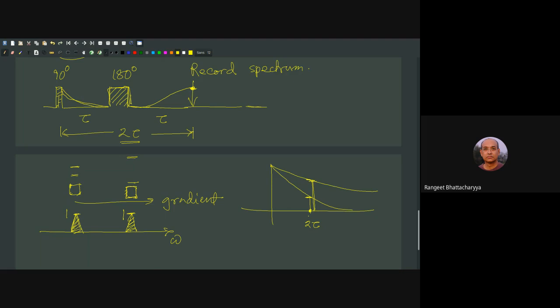Now suppose we have two boxes. This box has the deoxygenated hemoglobin, and this one has oxygenated hemoglobin. If we do this experiment, then for the deoxygenated hemoglobin the T2 curve is sharper, which means it falls faster.